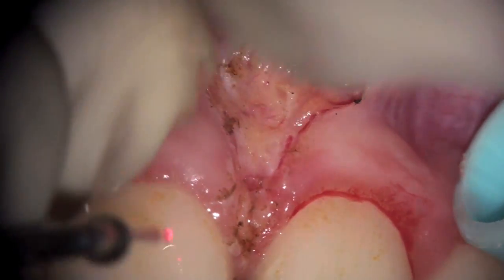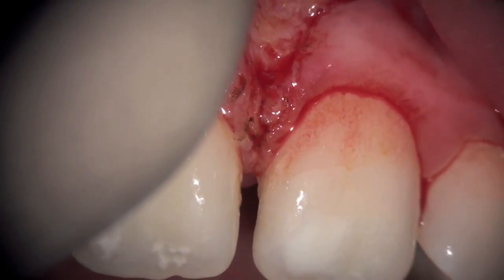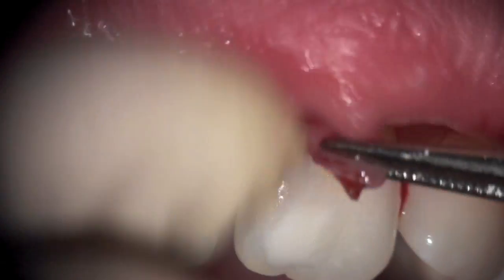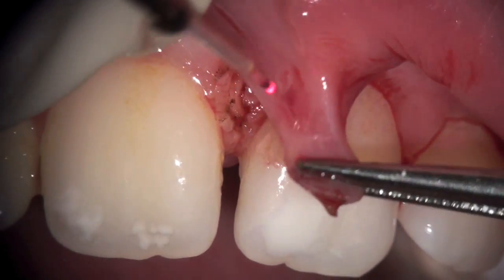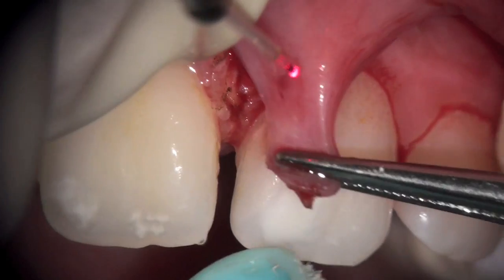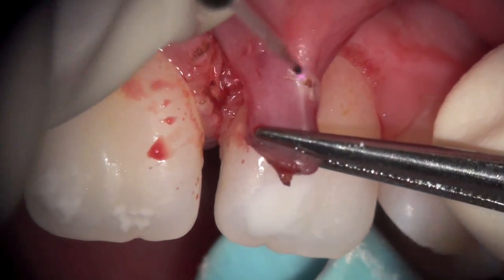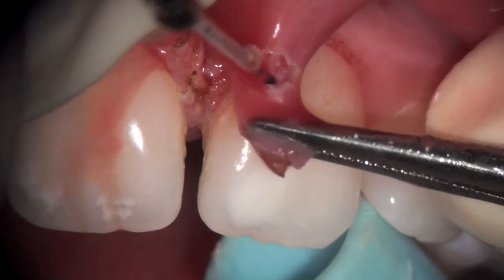Some people prefer, once they reach the periosteum, to use either a scalpel or something else to score the periosteum. We're removing a small tissue tag that was where the attachment was, at 5 watts with a light spray, and I'm holding the tissue with a pair of coagulating pliers — just removing this tissue tag.